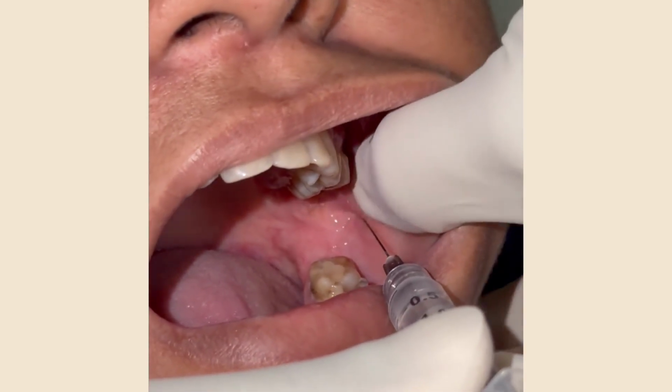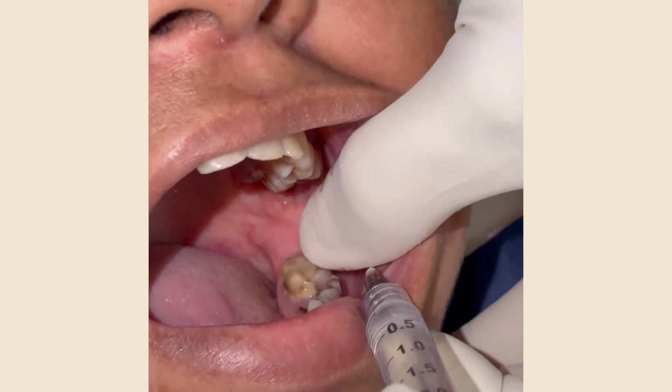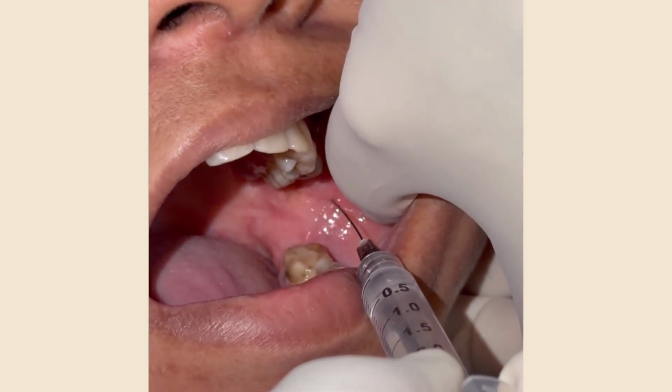The live demonstration shows the operator directing the syringe and injecting distal and buccal to the second molar to provide anesthesia.